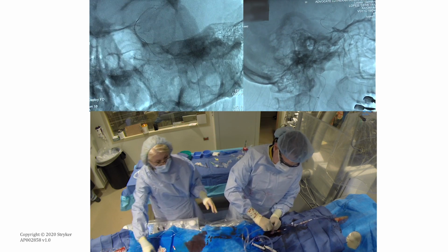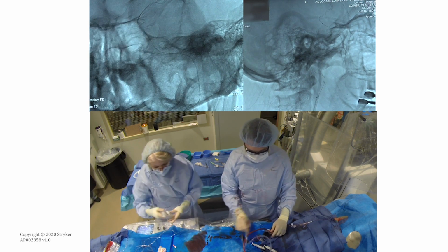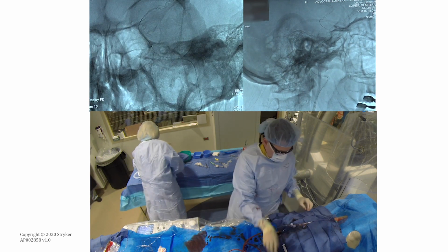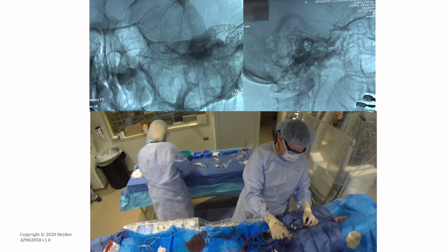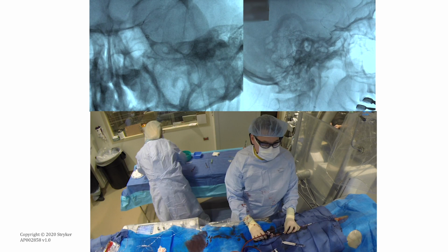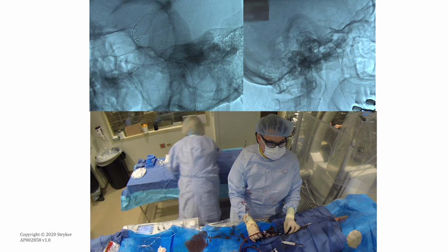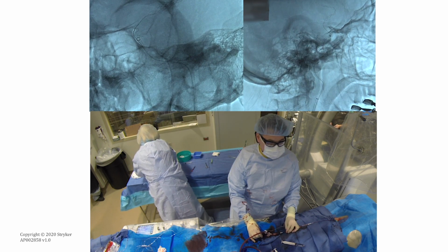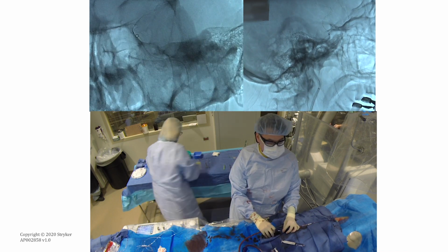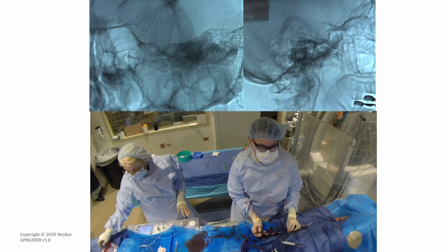You can see here as the aspiration catheter is going up into the more challenging anatomy, which is the cavernous, we start to connect to the aspiration, and the aspiration starts just proximal to the clot, and then you stop seeing the aspiration when you engage the clot. So we now have a combination: distally you have the stent retriever, and proximally you engage the clot with the aspiration starting just before you arrive at the clot.